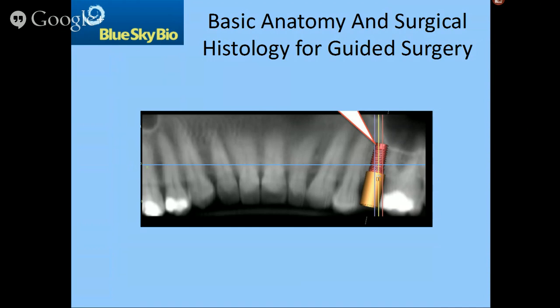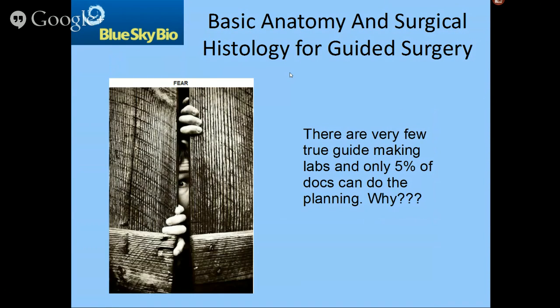And so again, the two will be joined together. I know that many of the labs out there look at the word histology and get scared, like, why do you need to know about histology? I understand that, but it'll be very easy and very simplistic. And the philosophy behind it is that the main problem with guided surgery, why more people are not doing guided surgery, is the difficulty in terms of the planning and the availability of software.